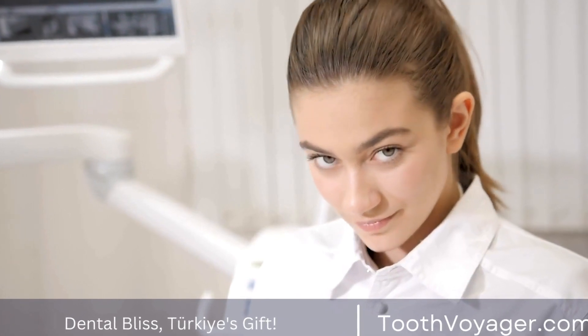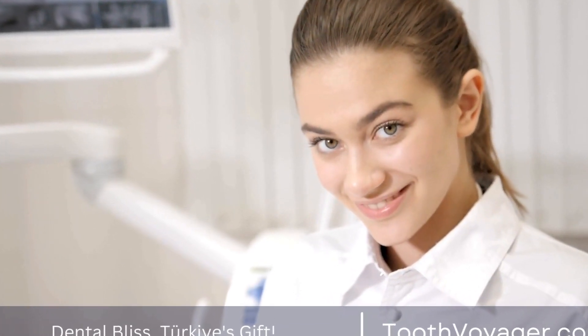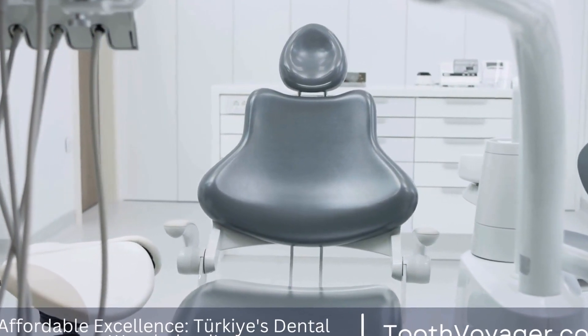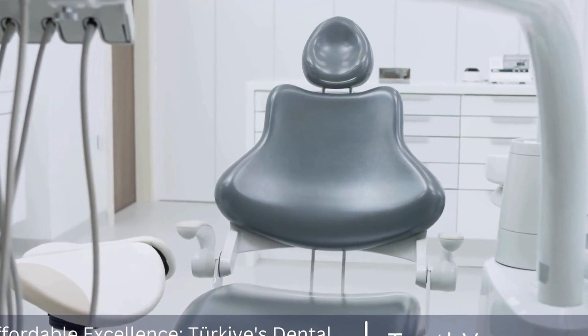Dental crowns play a crucial role in restoring the function and aesthetics of damaged or discolored teeth. They are designed to encapsulate the entire tooth structure up to the gum line, providing strength, protection, and a natural appearance.